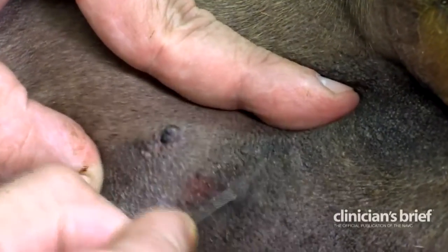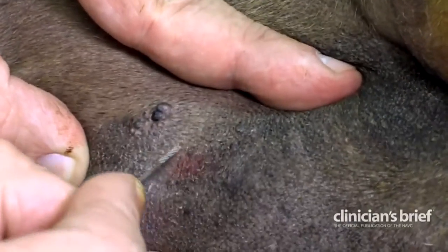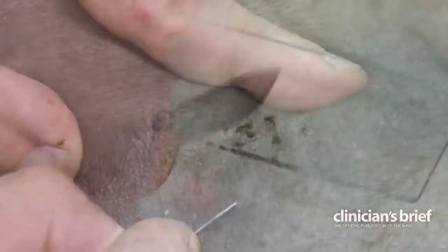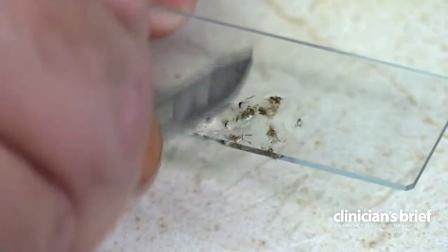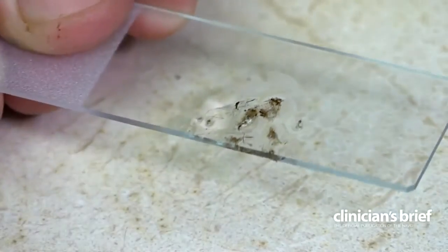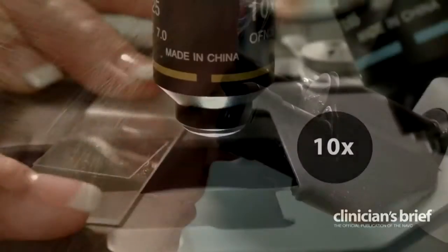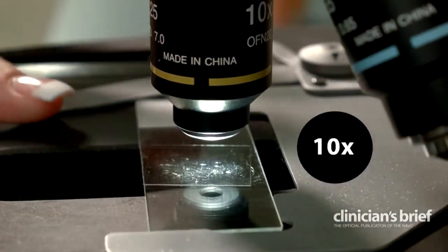Deep scrapes have the highest yield when performed until capillary bleeding is observed, indicating the scrape is deep enough to obtain material from the hair follicles. Collected material is placed in mineral oil on a glass slide, with or without a cover slip, and examined under 10X magnification.